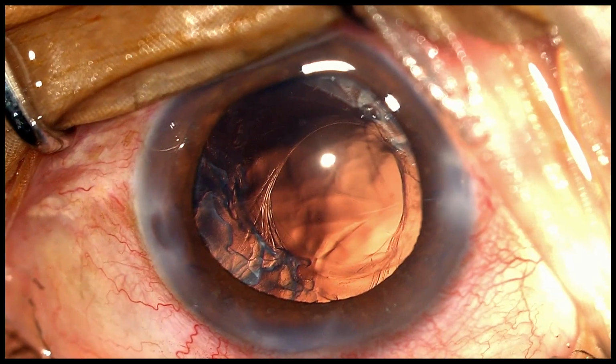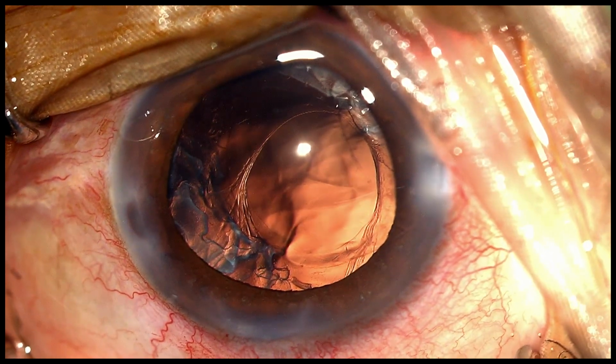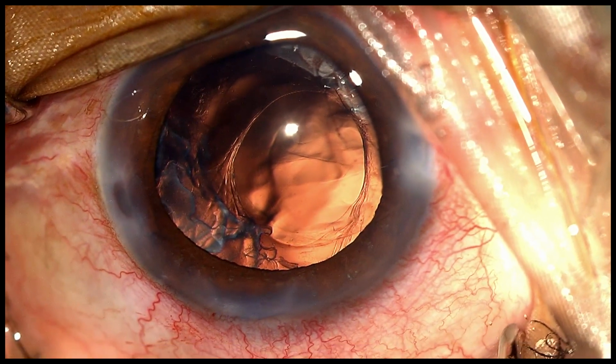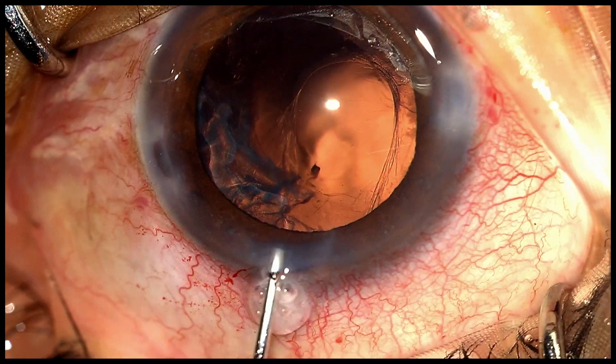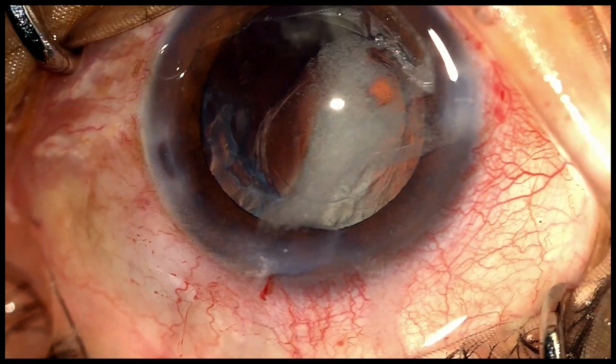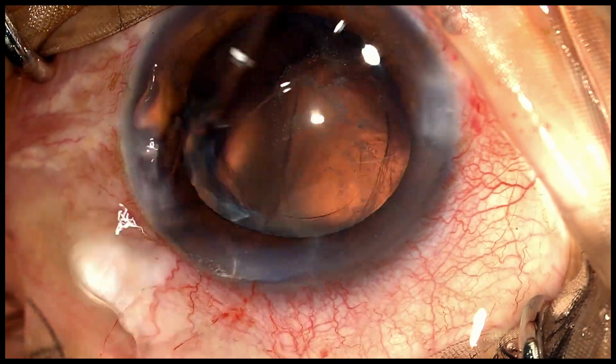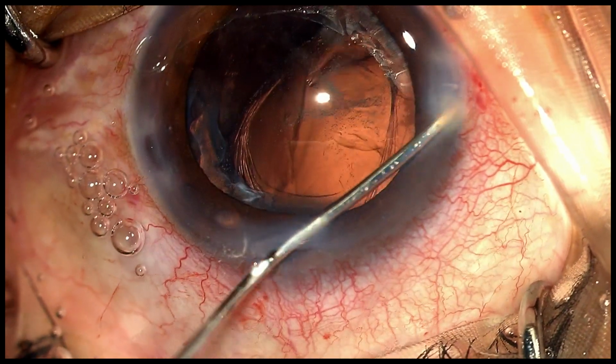There doesn't seem to be any disturbed vitreous, but we still have some amount of a residual epinuclear sheet between the 12 and the 4 o'clock position. In order to ascertain the presence or the absence of vitreous, I inject some diluted triamcinolone in the anterior chamber, after which I wash it.